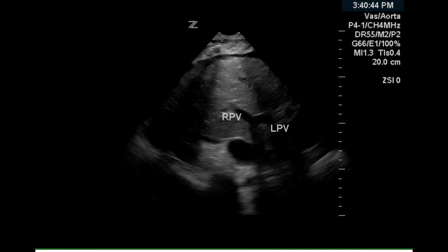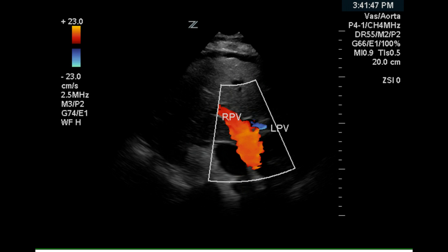Another image shows the branching of the main portal vein into its two branches. There is no evidence of thrombosis on this image. Color doppler also demonstrates complete filling of the vessel and no evidence of thrombosis.